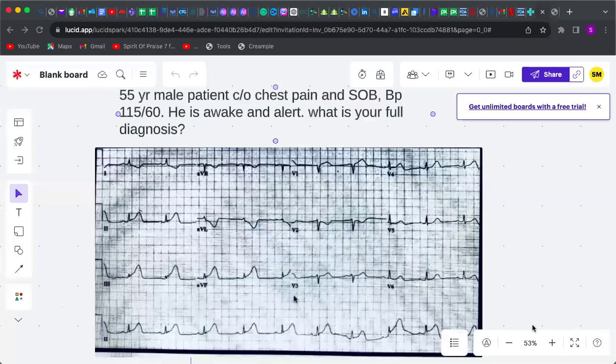So there are a few cases I would like us to look at today. So why don't we just delve right into them without wasting much time, okay? So I'll share my screen and then we would start off from there. So what do we have here today?